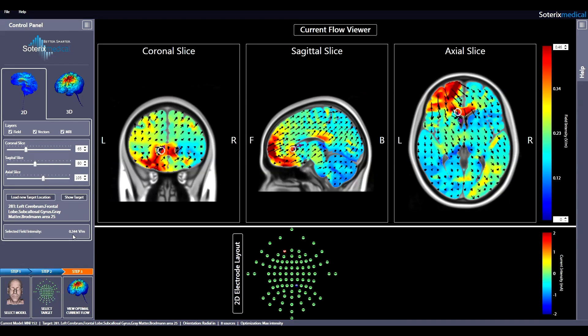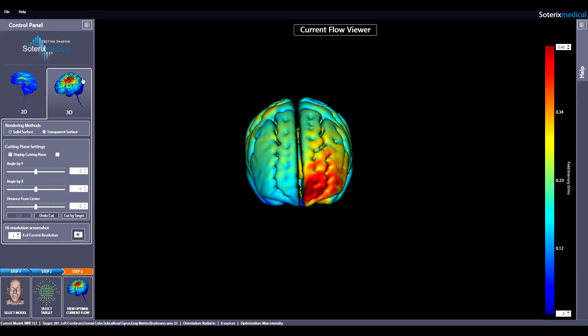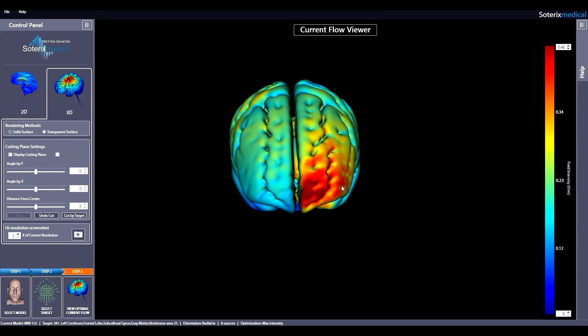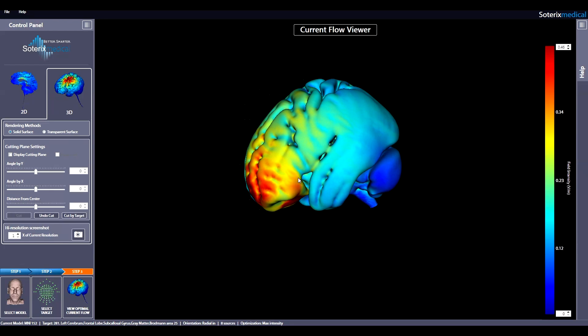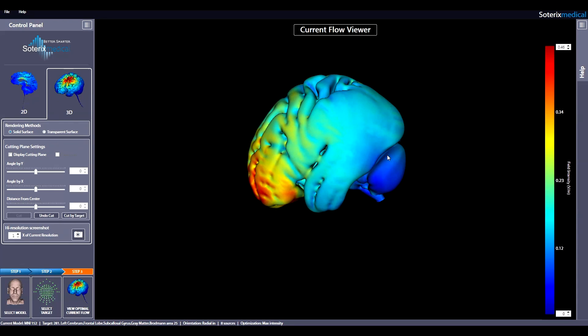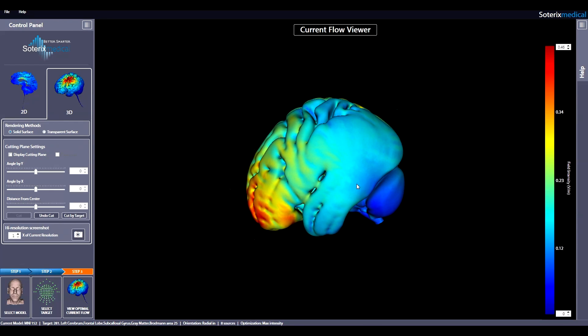To explore the current flow in 3D, just click the 3D option in the control panel. The model can be rendered either as a solid surface or a transparent surface. The solid surface is the default view. You can zoom, change views, rotate, move the 3D view as before using your mouse and keyboard.